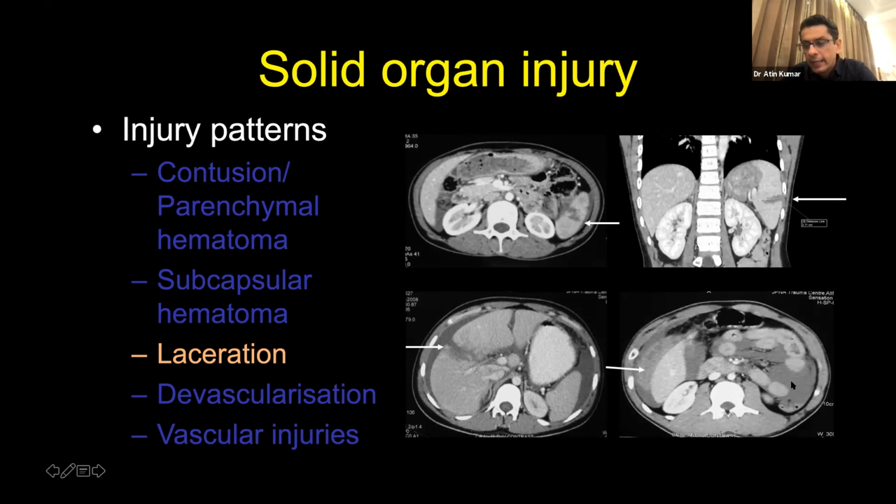If you see this, you see hemoperitoneum here in the interloop, also in Morrison's pouch, but in the perihepatic area, you see the hemoperitoneum which is hyperdense. This is the sentinel clot. This sign has got significance because it signifies that the area which is bleeding is close by only.